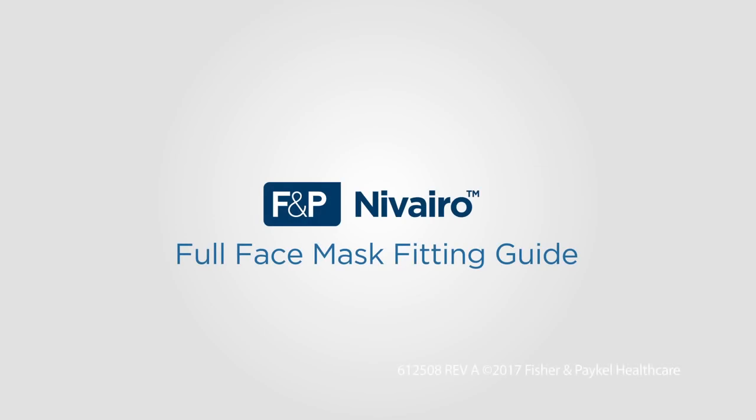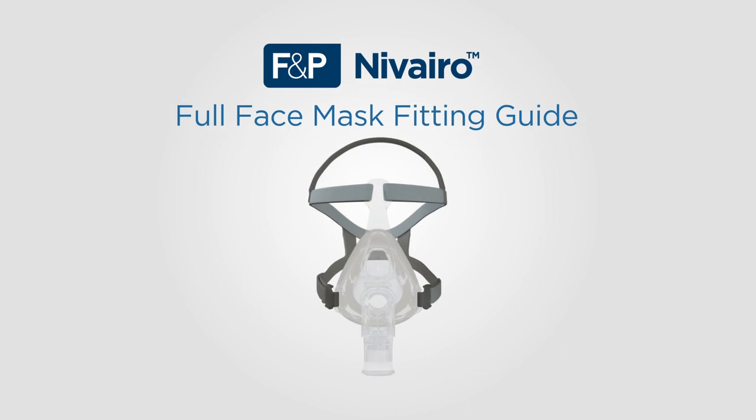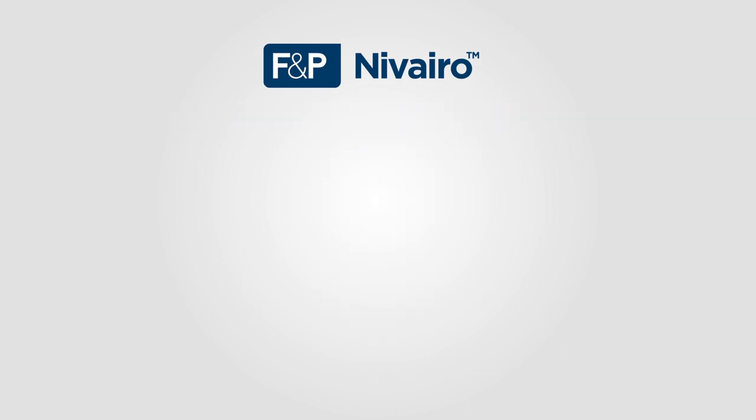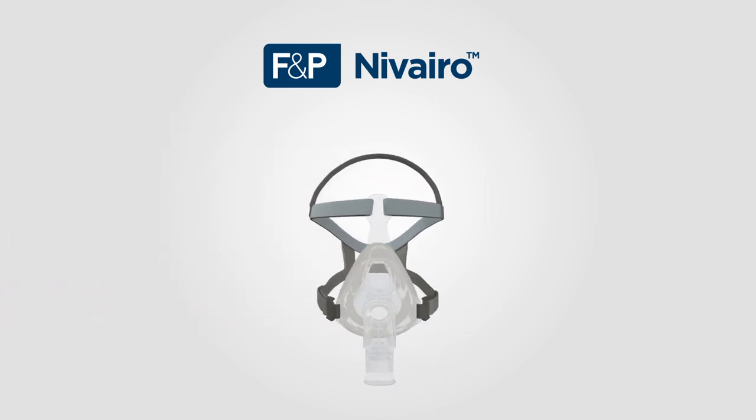Welcome to this short presentation on Nivairo Non-Invasive Ventilation Full Face Mask Fitting. Nivairo Non-Invasive Masks are single patient use for a maximum of 14 days. Always refer to the user instructions supplied with the product for a full list of instructions, warnings, contraindications, and explanations.